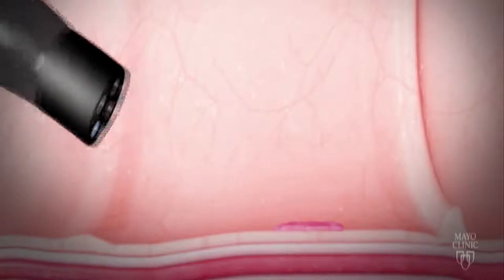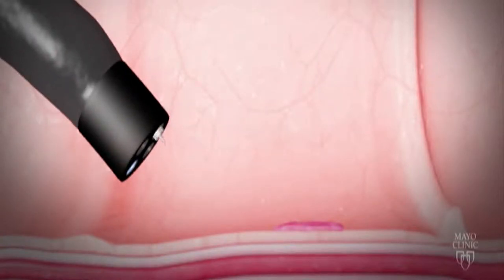In this video, we will show the basic technique for how EMR is done. The flat polyp is noted on the right in pink. The colonoscope is advanced through the colon to the site of the polyp.